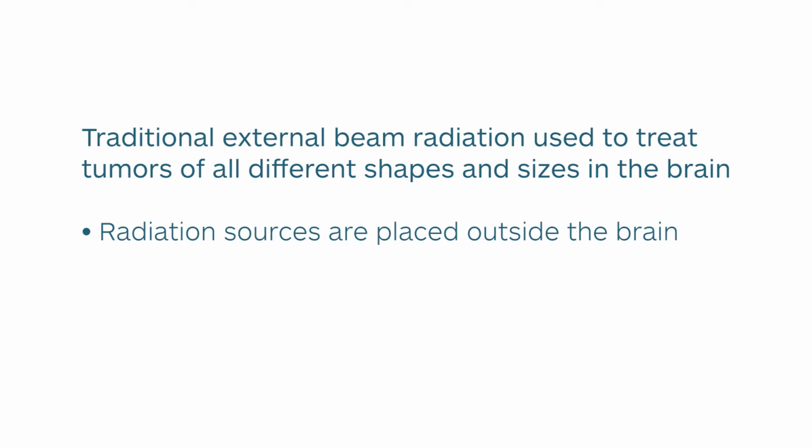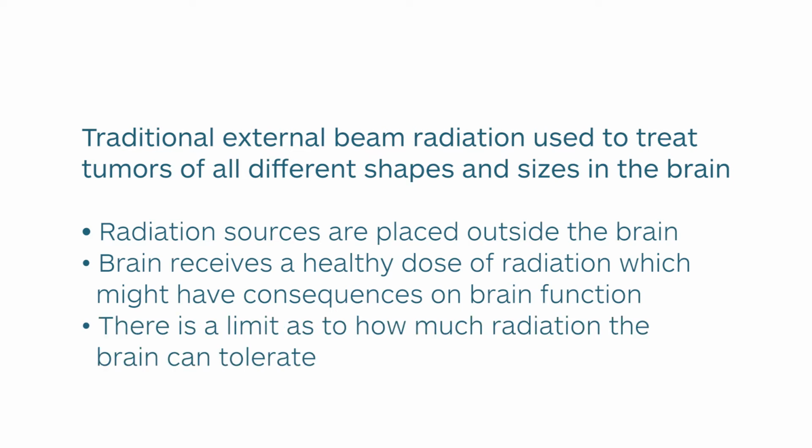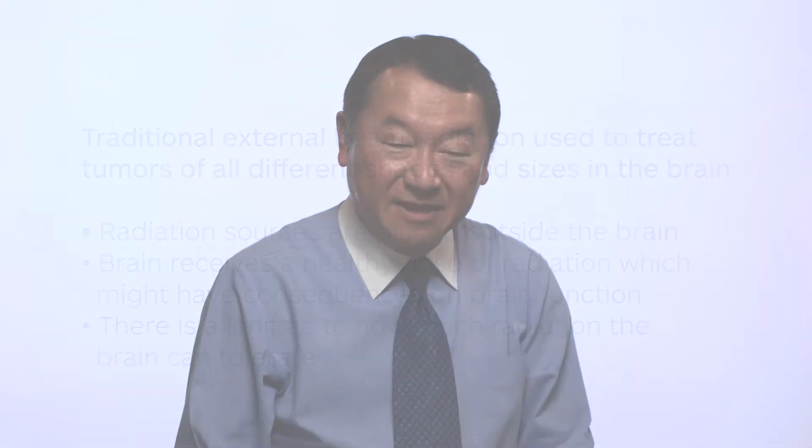The downside of that is, of course, that the brain, normal brain, gets a healthy dose of radiation, and that may have consequences for the function of the brain. And there is a tolerance limit to how much radiation the brain can take.